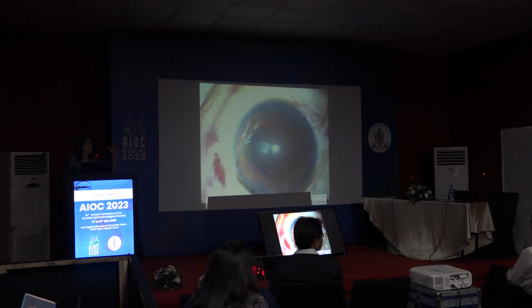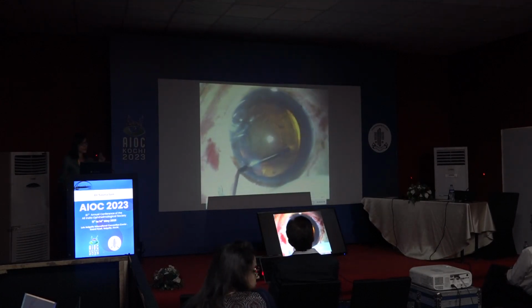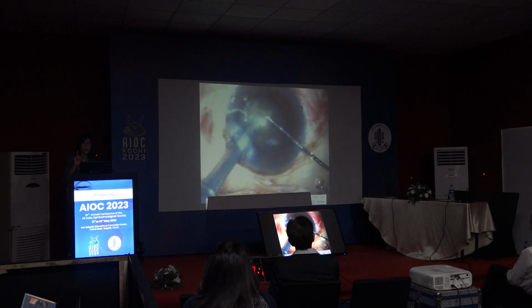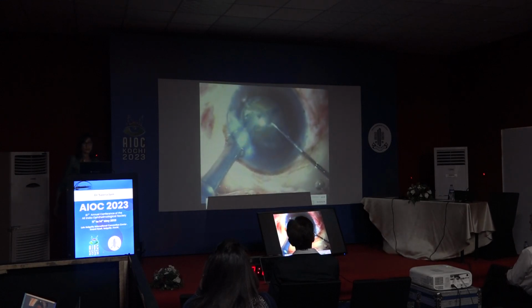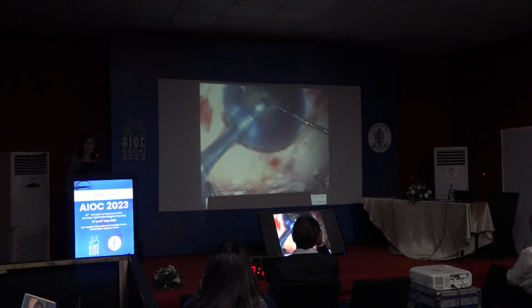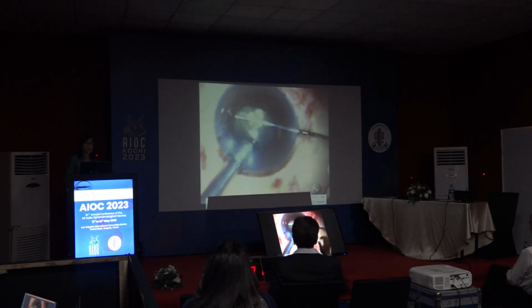This is a case with a little harder cataract. So what do you do when you're performing a polar cataract surgery? Again, as you can see, with these hard cataracts, it's slightly difficult to perform a hydrodelineation. First chop, again, try and do a limited lateral separation. This is a little more than I needed to. Remove a bit of the nucleus.